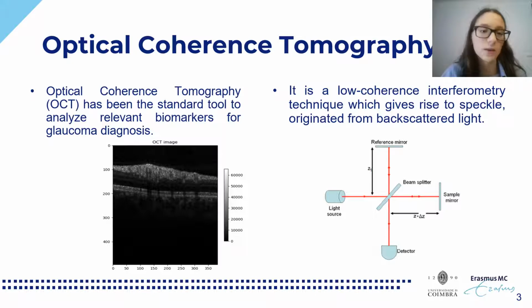You can see that there are darker and brighter spots. So that is called the speckle pattern.